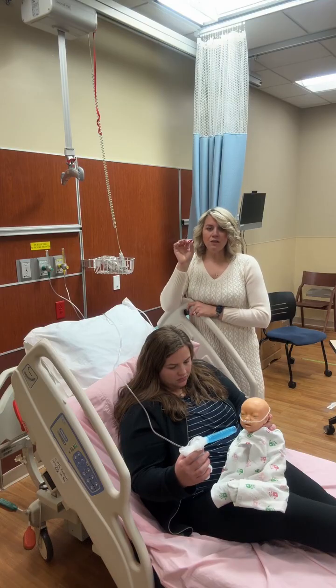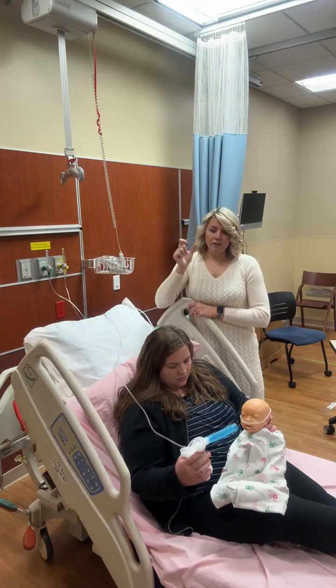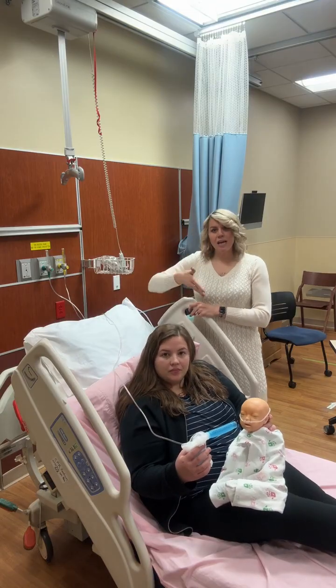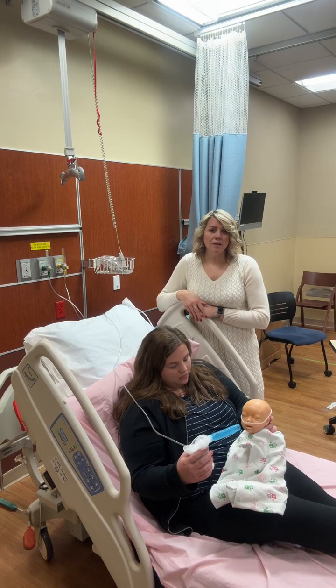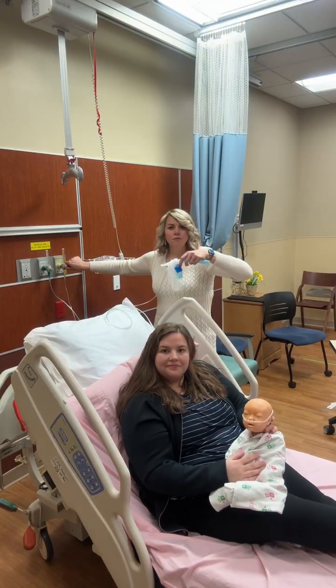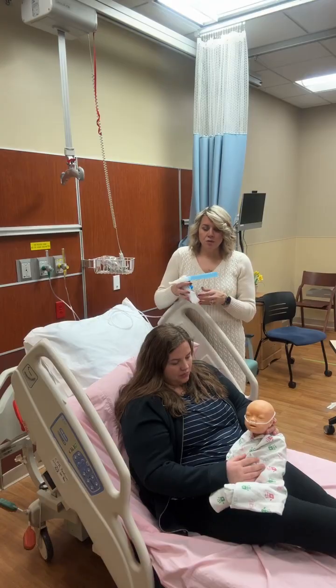So when you don't hear it making that little spurt noise, that means that your neb is done. Okay, so sometimes I shake it a little bit to make sure I get it all. Okay, and nothing's coming out of it. So in this situation, our time is up, or the medication is gone and we've nebulized the medication. So then I will take the cup from the parent and then I will turn it off. All right. Then you would reassess your patient as you would normally do.